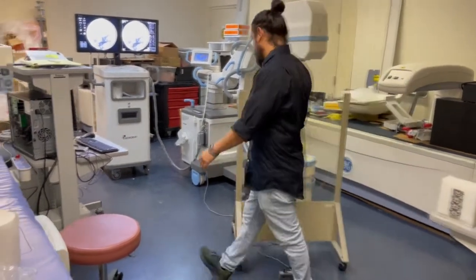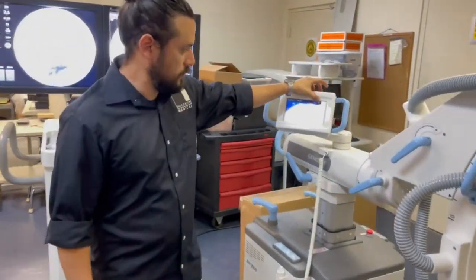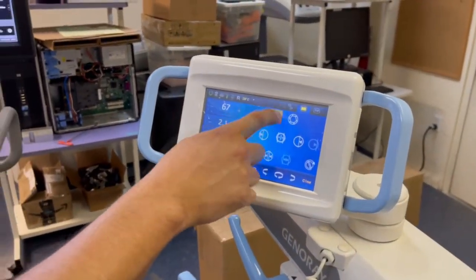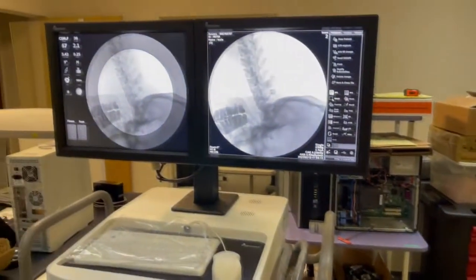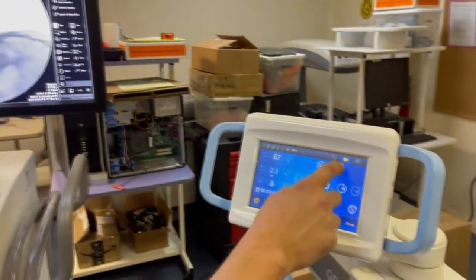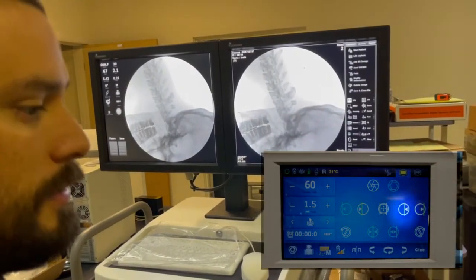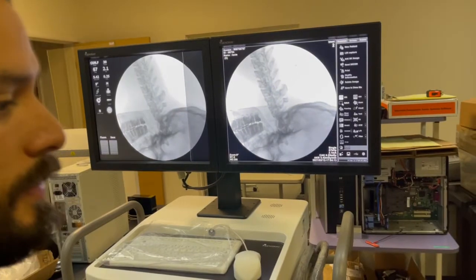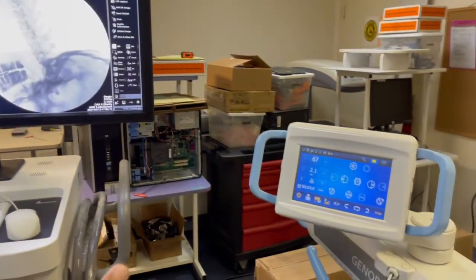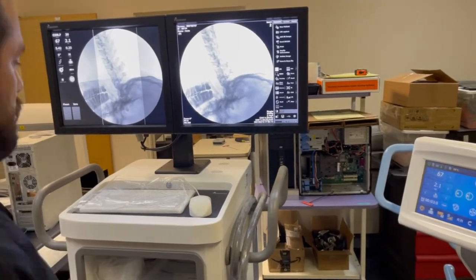Another nice feature that comes with the Zen 7000 is the collimation. The collimation is virtual, so you know how small it's going to be before you take an exposure. You can also move one leaf at a time — you don't need to move both. It has a center button that will bring everything back to open, and the regular motion moves both leaves at the same time. All virtual.